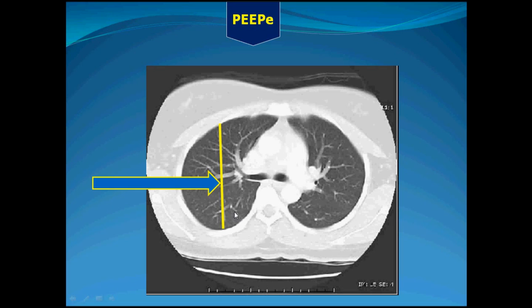That's why we put a PEEP 1 to 2 centimeter water more than the superimposed weight in order to keep these dependent alveoli open. This is another issue, and this will help us to understand what will happen in patients in whom the lung is full of fluids, so the weight will be larger, so we need a larger PEEP in order to keep these alveoli open.